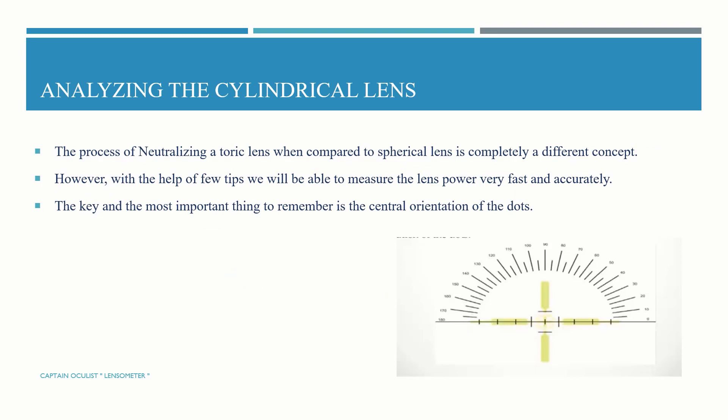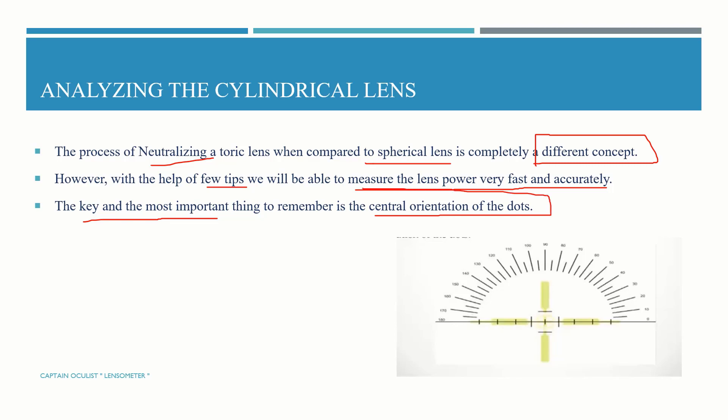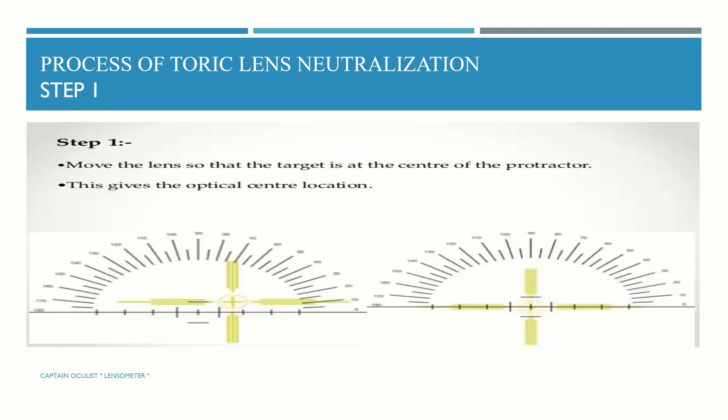Analyzing cylindrical lenses: the process of neutralizing a toric lens, that is a cylindrical lens, is completed in a different concept compared to spherical lenses. However, with the help of the proper steps, we will be able to measure the lens power very fast and accurately. The key and most important thing to remember is the central orientation of the dots.